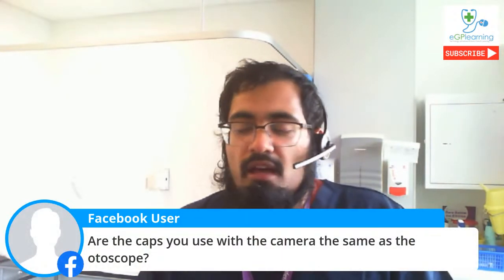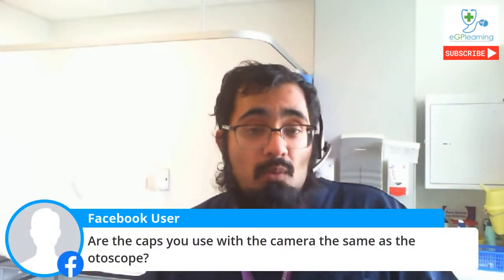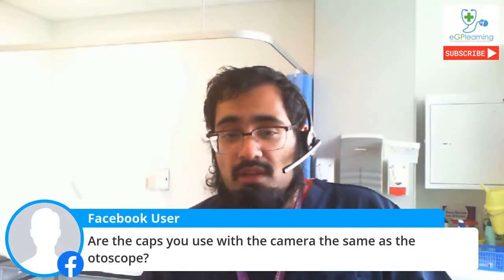And are the caps with the camera the same as you use with the otoscope? The ones you get with the otoscopes, no, if you want the actual versions, but as you've just seen, I use the normal ones as long as you push it far enough in. The only issue is if you get the round edge ones, they don't always fit, so bear that in mind. And you have to use two hands to make sure you don't poke the patient in the ear or anything like that, but it works well and it works effectively and it's disposable, so that helps for infection control and all that kind of stuff.